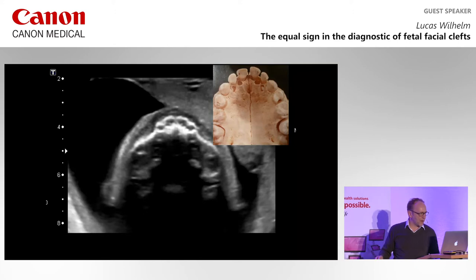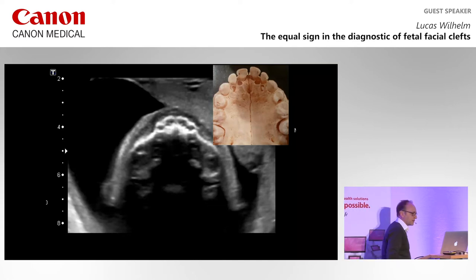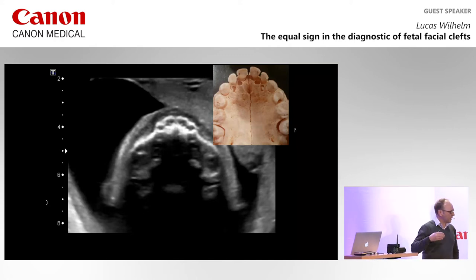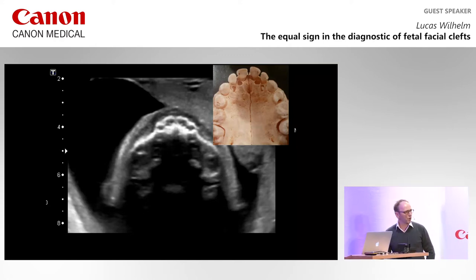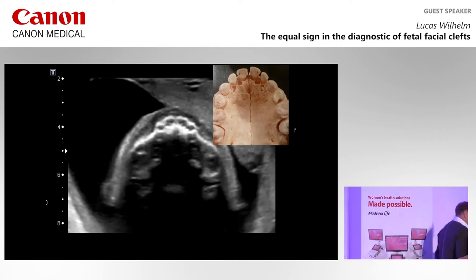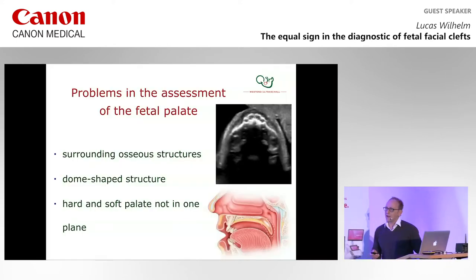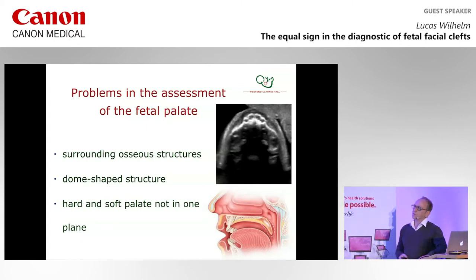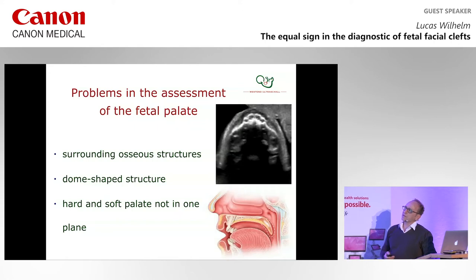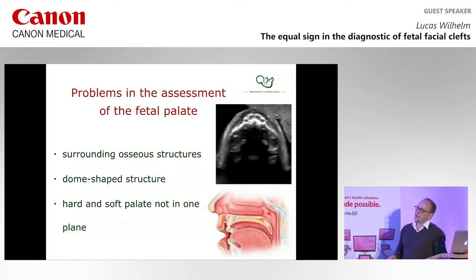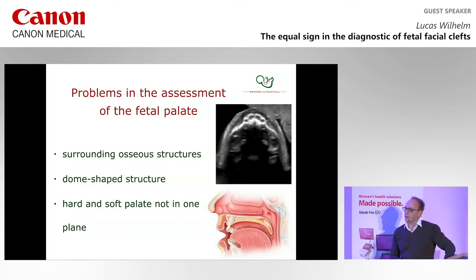The clefts in the alveolar ridge you have to find between the second incisor and the canine teeth. When you find a cleft here, the problem starts — and the problem is this black hole. The most common problems with assessment of the palate are the surrounding bony structures causing shadowing artifacts and preventing assessment of the palate. Two other issues are the dome-shaped structure of the palate and the fact that the hard and soft palate are not in one plane.